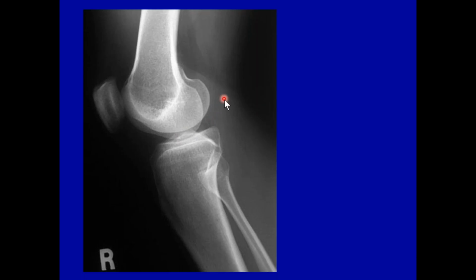Why is it larger? Because biomechanically, you bear more weight on the inside of your leg, all right, on the medial meniscus, on the medial joint compartment. And to get around that fact, we're using a straight line, the central ray, to try and visualize an anatomic curved structure.